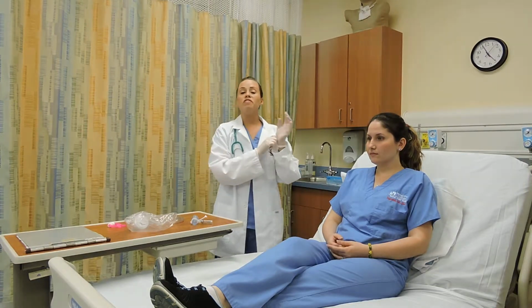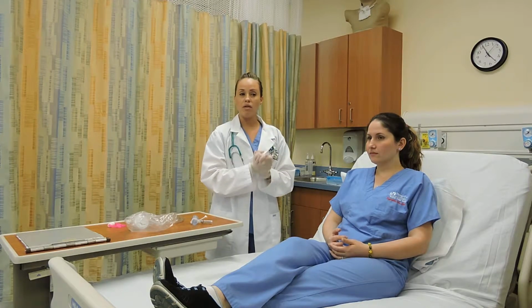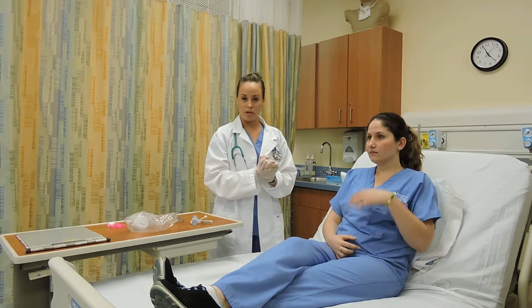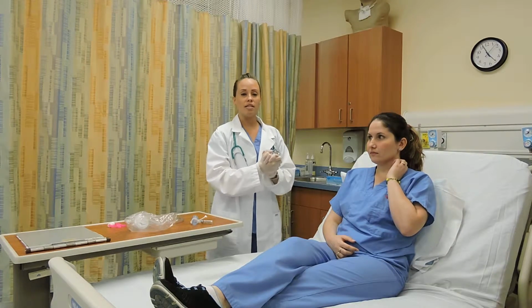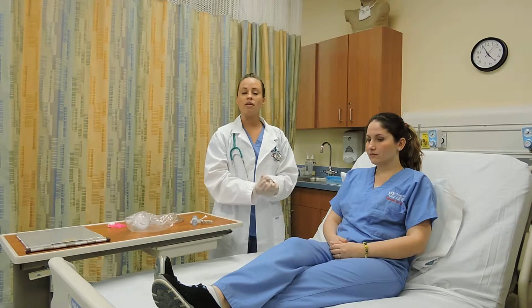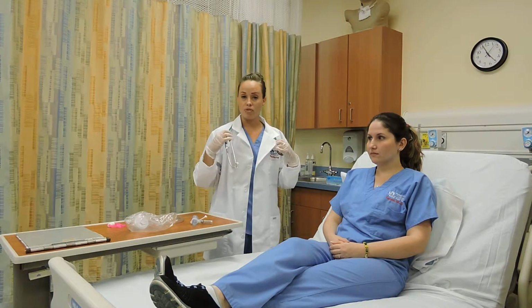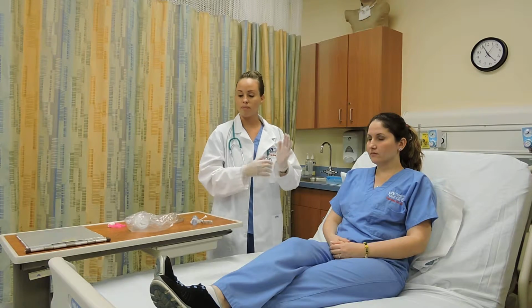I'll make sure to verify my patient's identity using two identifiers. These can be name or medical record number. Then I can proceed and assess my patient's vital signs, respiratory rate, heart rate, blood pressure, temperature, and SpO2, and breath sounds, which I'm also verbalizing only.